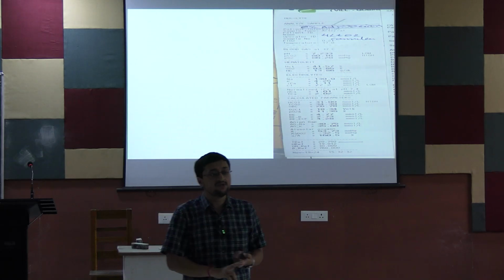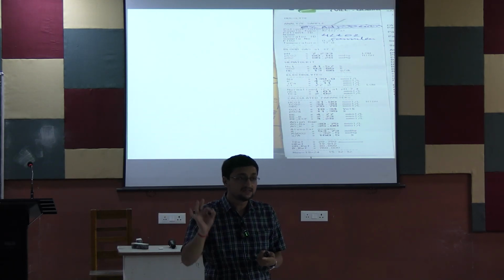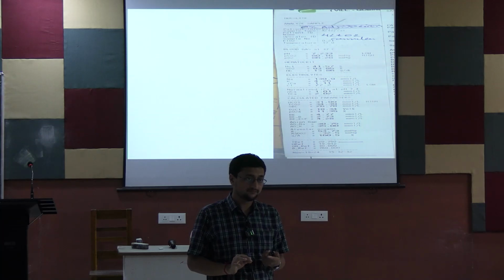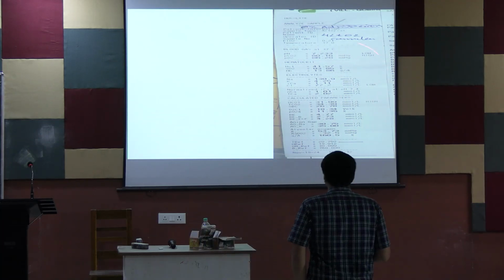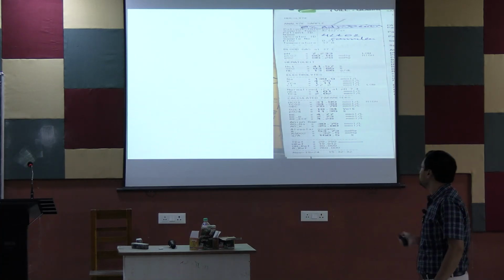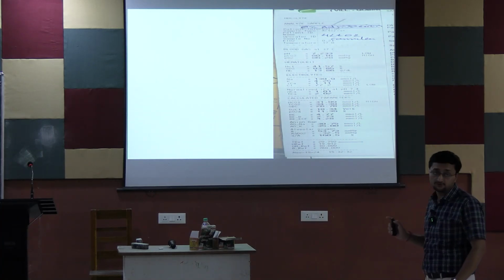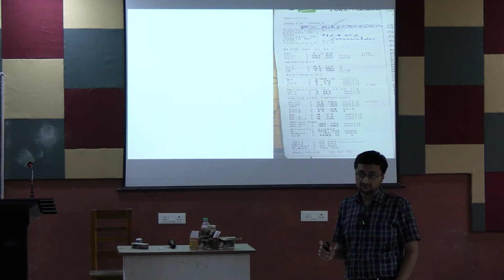So there will be errors in measurement if you do not mention the FiO2 or liters of oxygen, right? So next one is pH, and এই প্যারামিটারস গুলো খুব ইম্পর্টেন্ট, pH, PCO2 and PO2. These are the primary parameters of ABG.